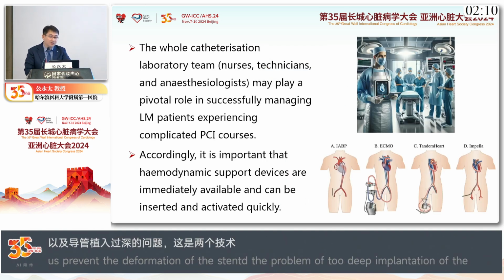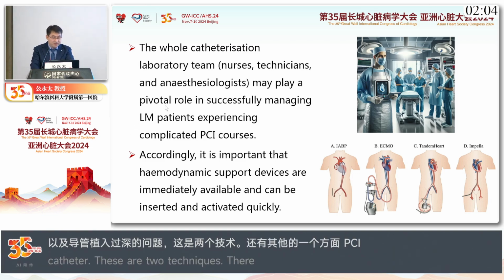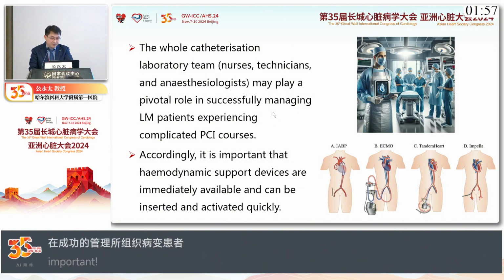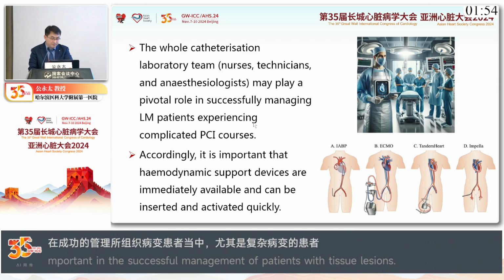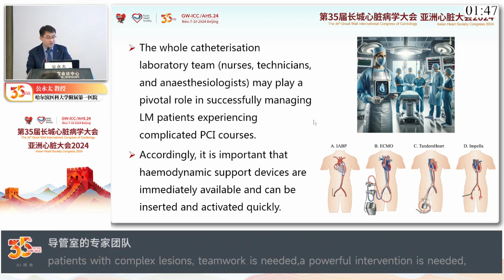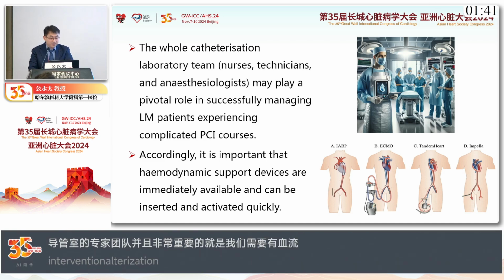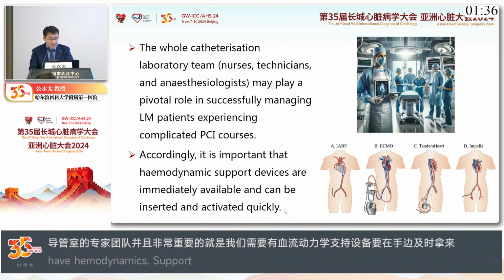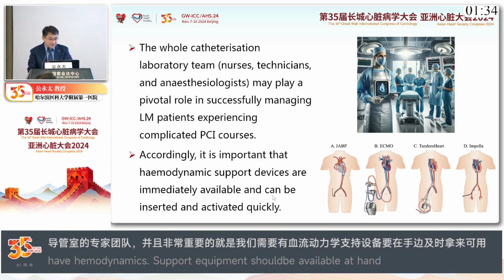Of course, the PCI team may play a pivotal role in successfully managing patients with left main disease, especially when the patients experience complications. Accordingly, it is important that hemodynamic support devices are immediately available and can be inserted and activated quickly. Thank you very much.